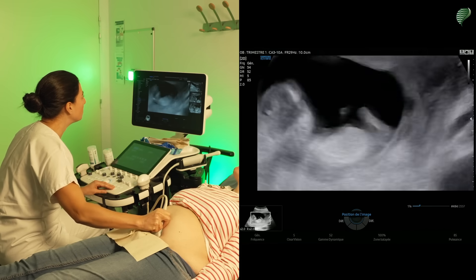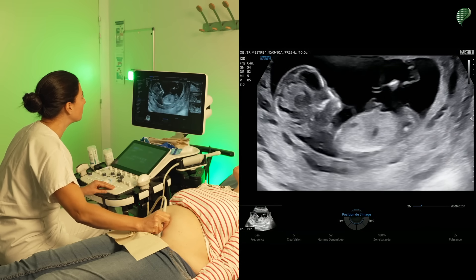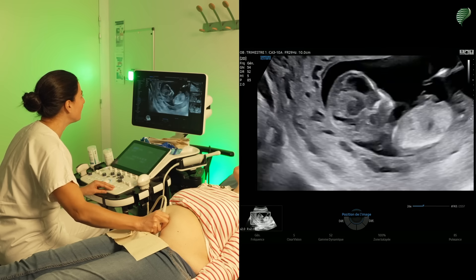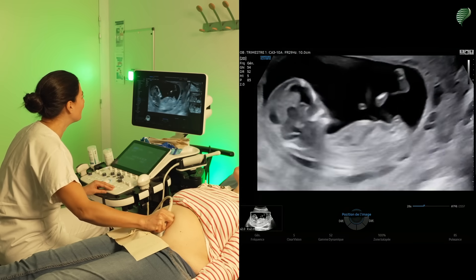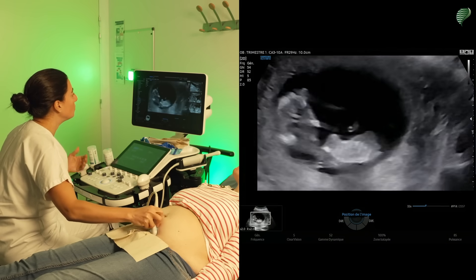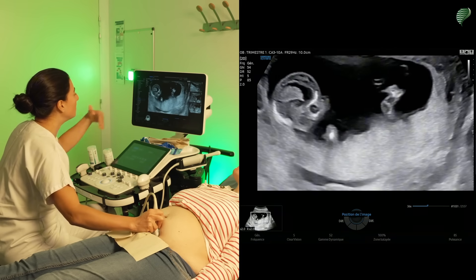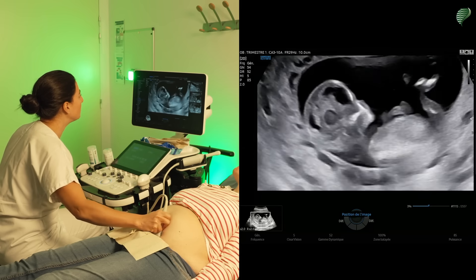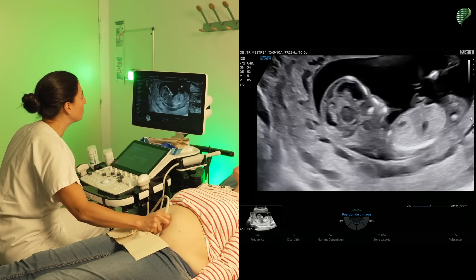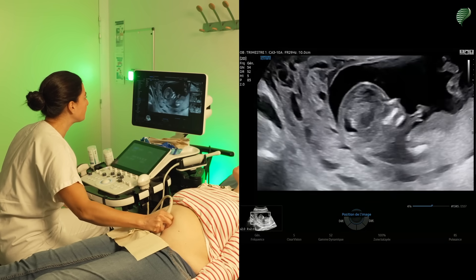I'm bothering him a little to see if he's willing to move — it's a matter of patience between us to see who's most patient, and I normally win. During an examination it sometimes happens that you can't see everything at once, so you need to come back a little later. You progress in your examination, follow a slightly different order, and after a while you end up seeing what you want in a relatively acceptable time.